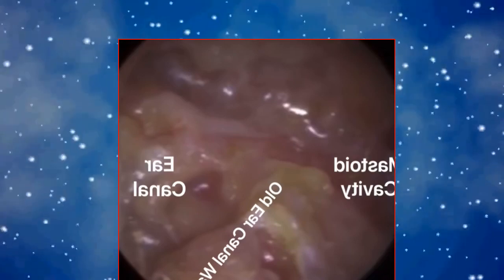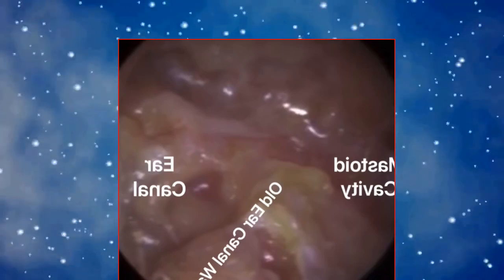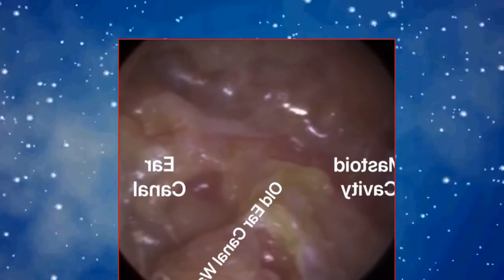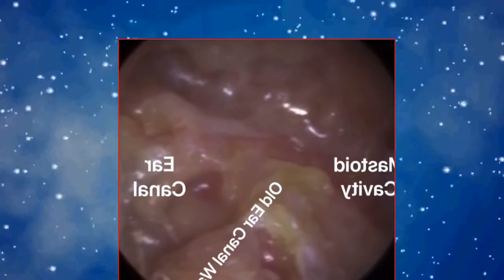The benefit of that is that the ENT surgeon can be really sure that there's no dead skin left behind, because you've opened up the canal completely and you can see everything. So there's a really minimal chance of a recurrence of a cholesteatoma or mastoiditis. However, when you've got a big open mastoid cavity, skin doesn't migrate as well. So that skin, as you can see, is just layering, coating the canal wall. So an open mastoidectomy needs regular cleaning. This skin does need to be cleaned as it's not shedding naturally, because that skin can get infected.